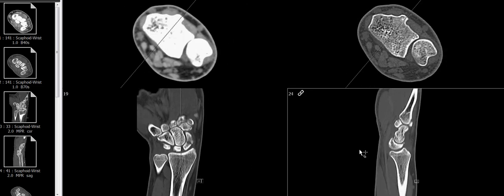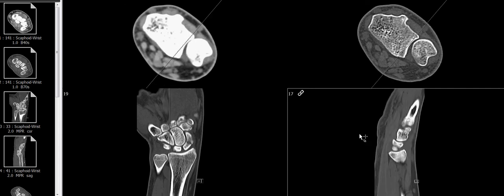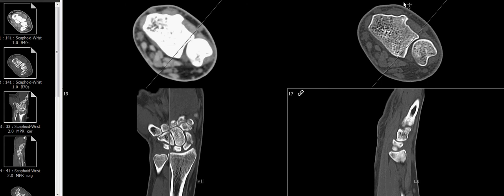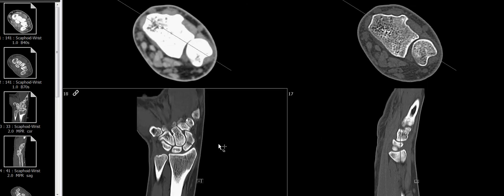Too often I see people reformatting images according to the tabletop position. In MSK imaging, the wrist is one example — you always have to do it along the axis of the joint. And of course the landmarks are different for each joint.